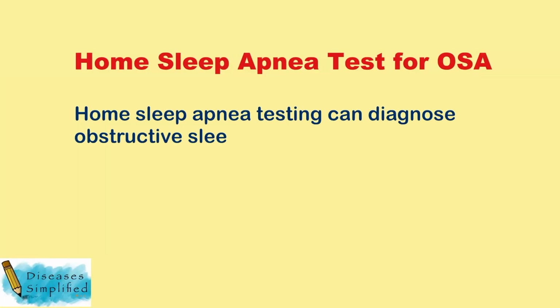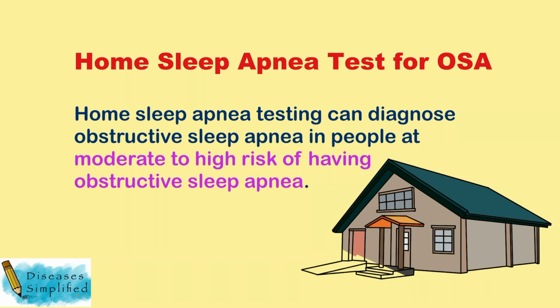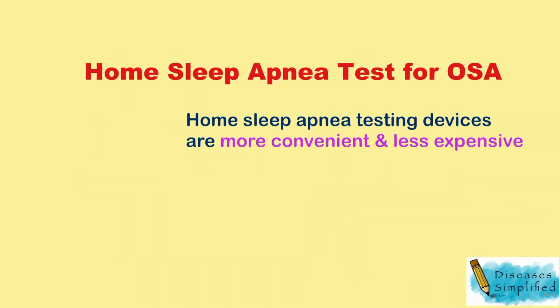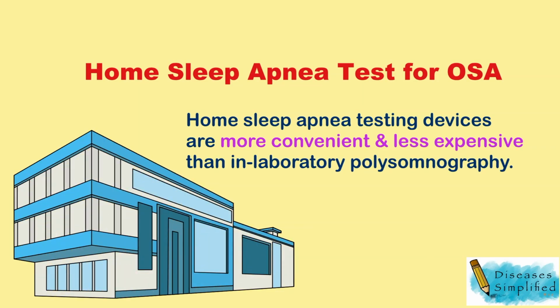Home sleep apnea testing can diagnose obstructive sleep apnea in people at moderate to high risk of having obstructive sleep apnea. Home sleep apnea testing devices are more convenient and less expensive than in-laboratory polysomnography.